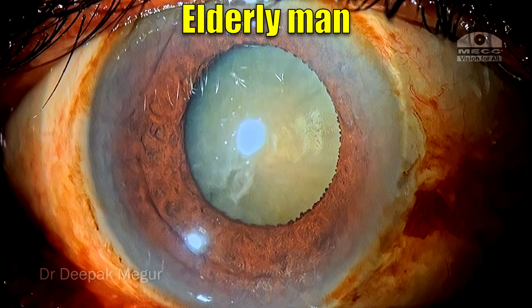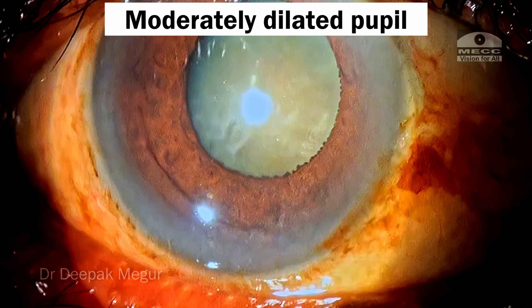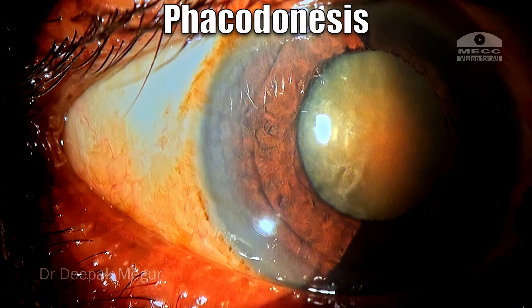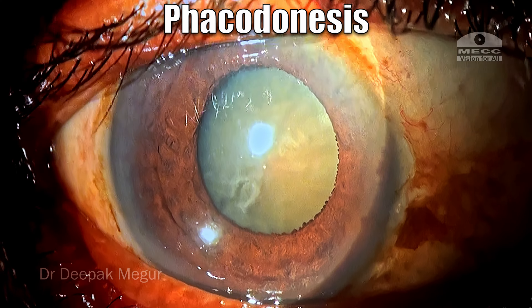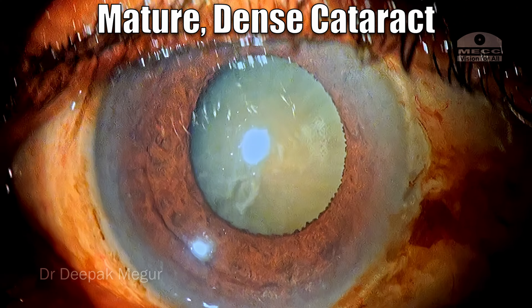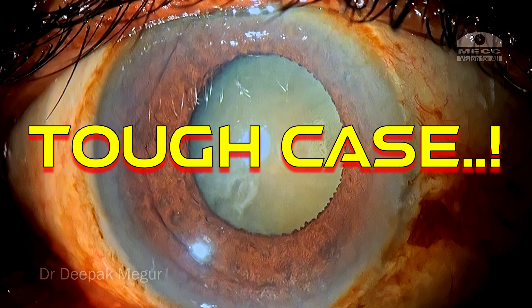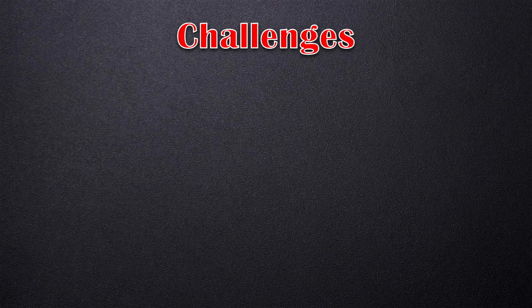An elderly male patient with pseudoexfoliation, moderately dilating pupil, and the more problematic issue here is the presence of phacodonesis — a cause for concern. The patient also has an underlying mature dense cataract. This is a difficult case, and these are the challenges I am thinking about now.